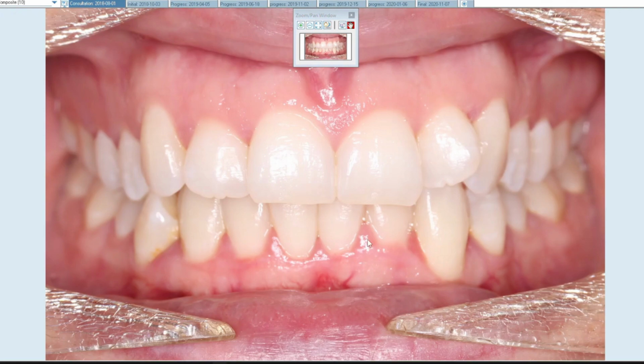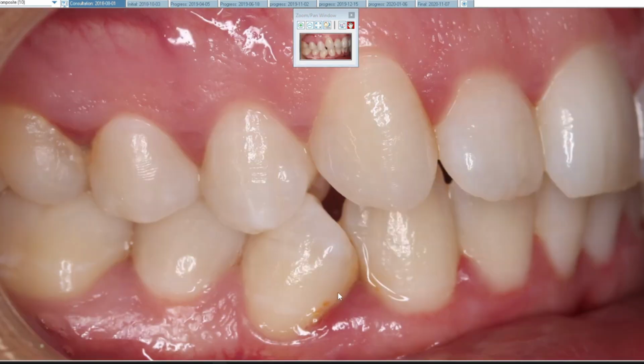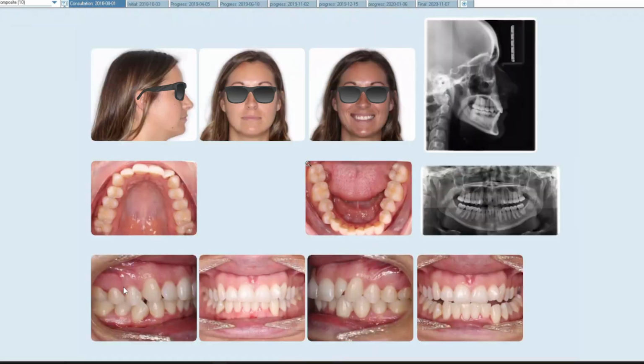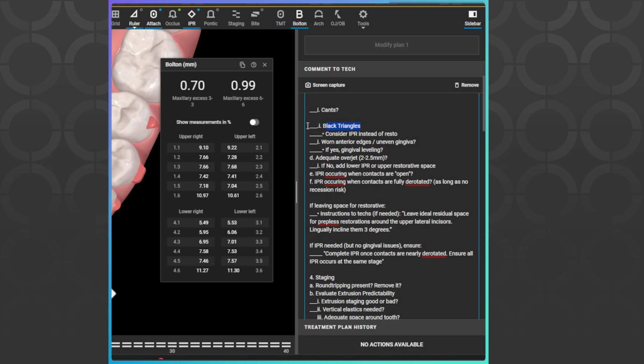And you see here that the biotype is actually great. These gingiva here are really, really thick and juicy on the bottom. So I'm not really worried about recession occurring. Hygiene can definitely be improved on, and always check to see if there's calculus gluing the teeth together. But all in all, I'm not too worried about the biotype of the gingiva, and so that's great. So we don't need IPR for fragile tissue in combination with severe crowding.